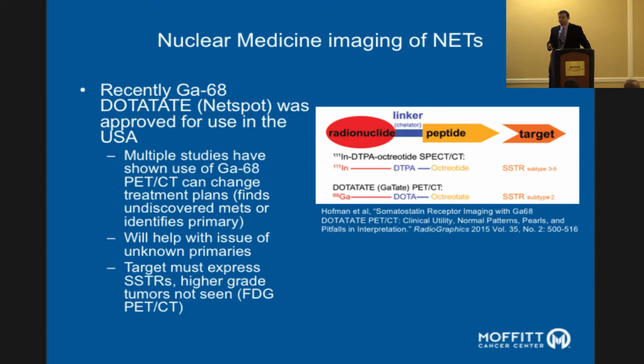And it's a great technology because it's far, far more sensitive than the Octreoscan, yet you can accomplish it with a lower radiation dose than you would with an Octreoscan. So it's really a win-win situation.